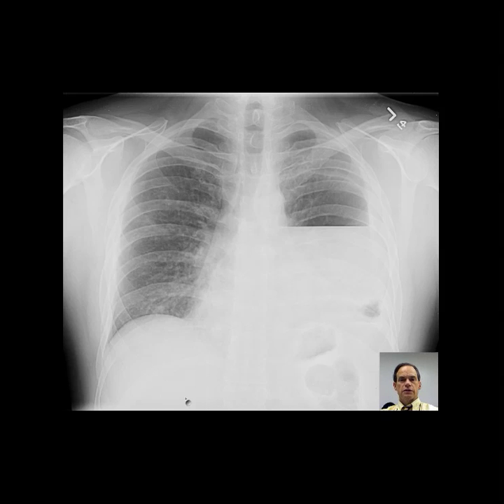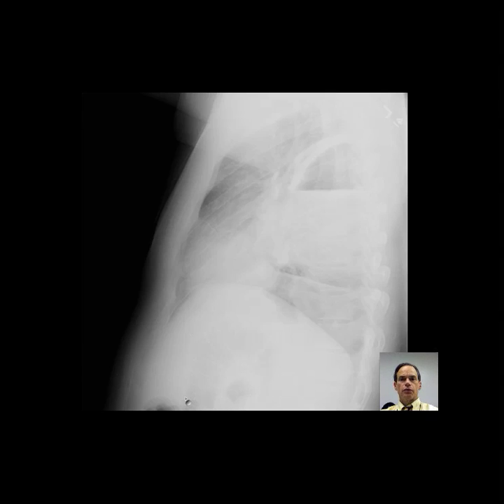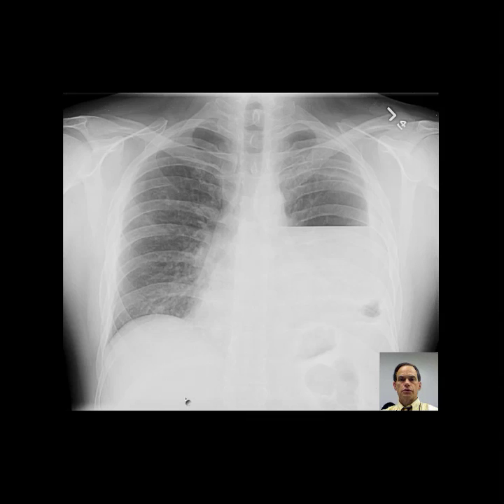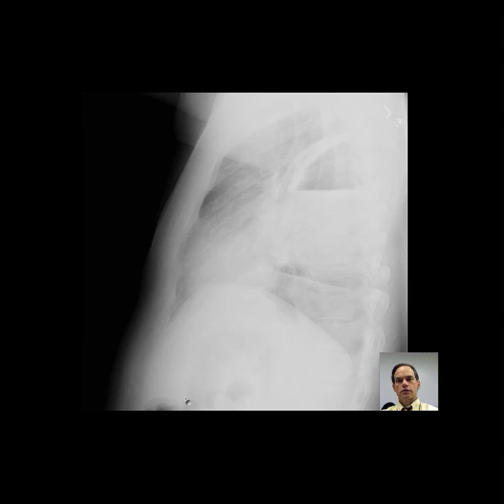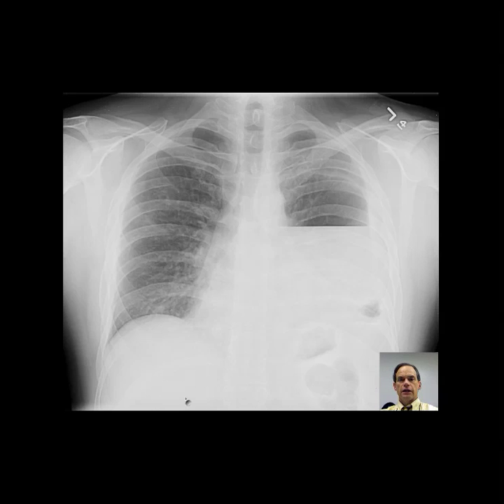Hello there, Dr. Mintz. This is my report for the two views of the chest, PA and lateral.